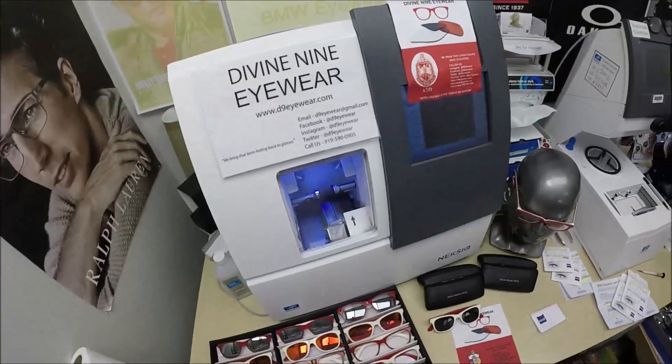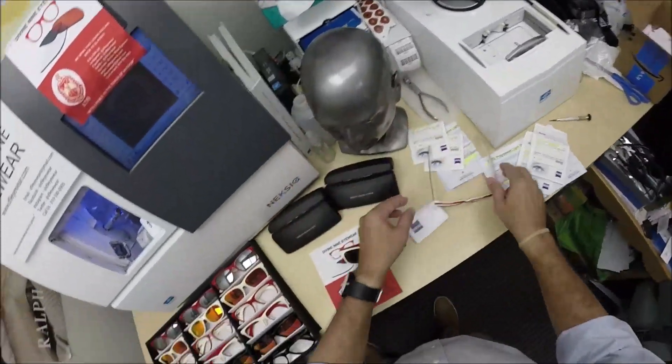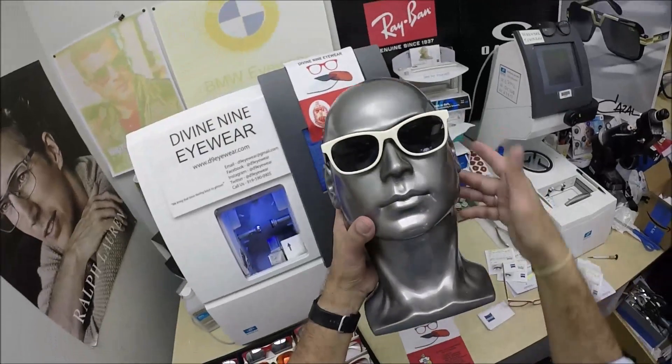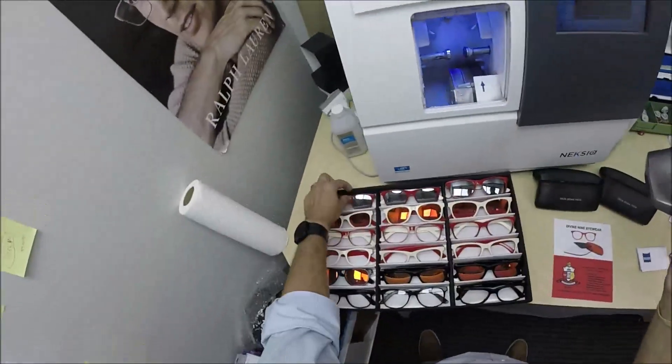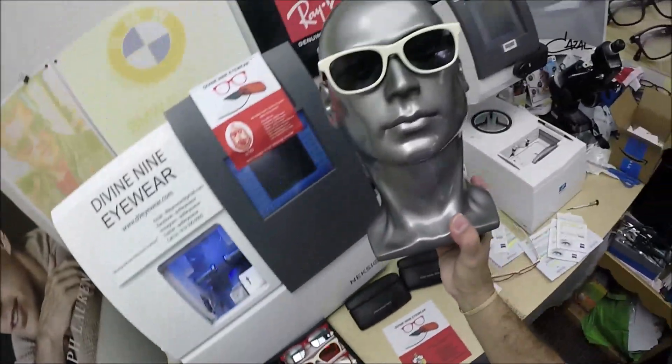Any of the features are available: if you want self-tinting lenses that turn dark when you go outside, I can do that. I can do anti-glare treatments, mirrored lenses. You can get polarized gray in the red, polarized gray in the black — whatever you need.